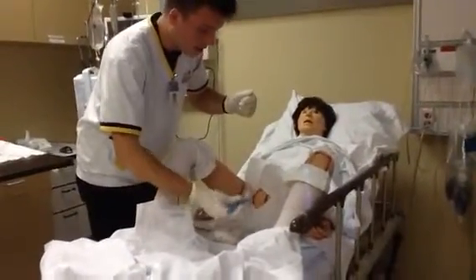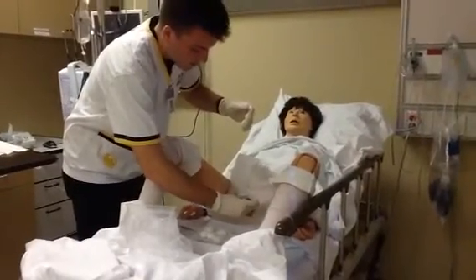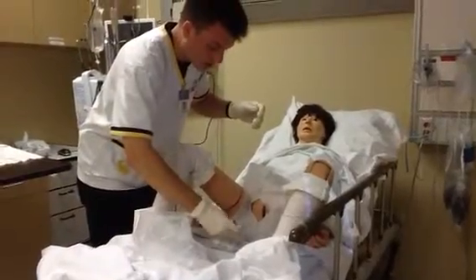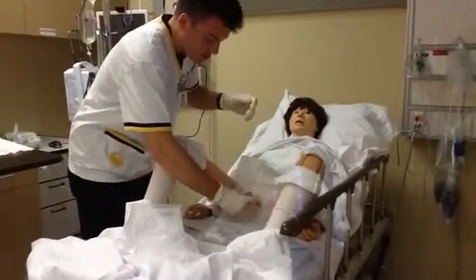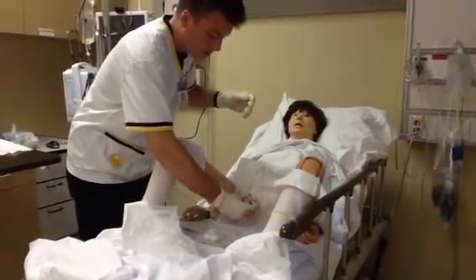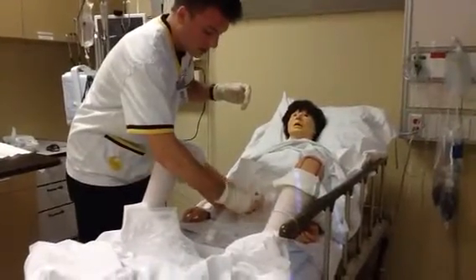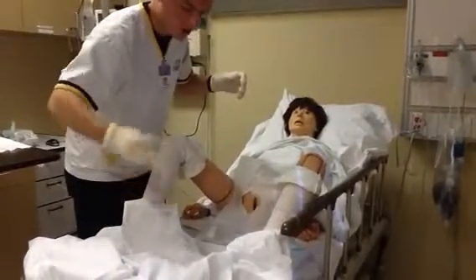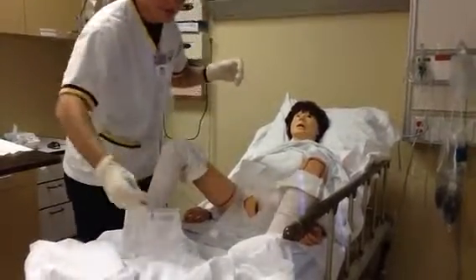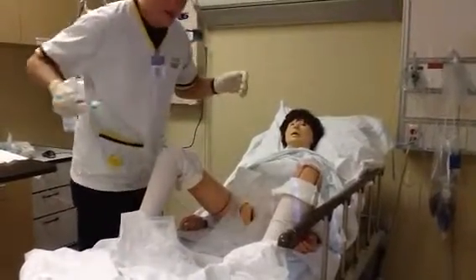So I'll take a cotton swab. I will go with the labia majora, come around and drop. I will do the other labia majora, come around and drop. Labia minora, come around and drop. Labia minora, come around and drop. And going from clitoris to anus, down the middle, coming around and drop. And once again, clitoris to anus, coming around and drop.